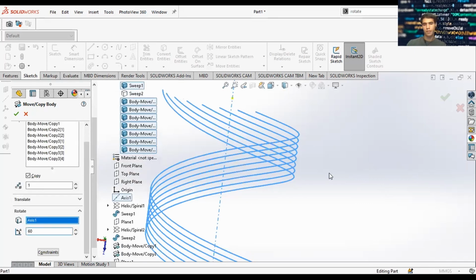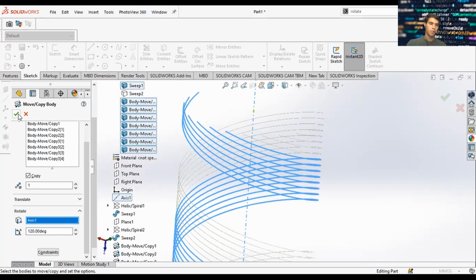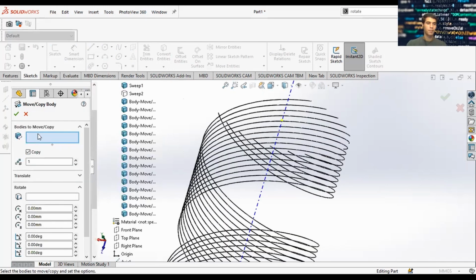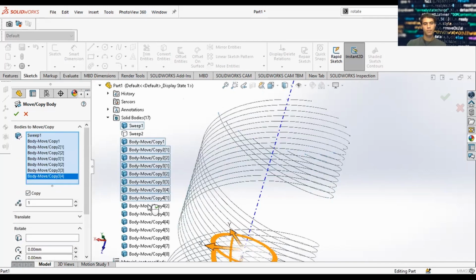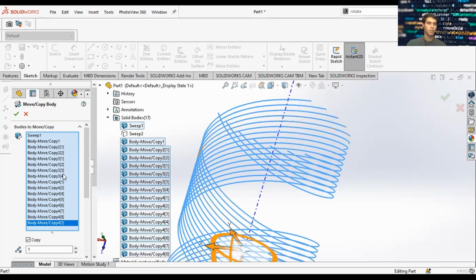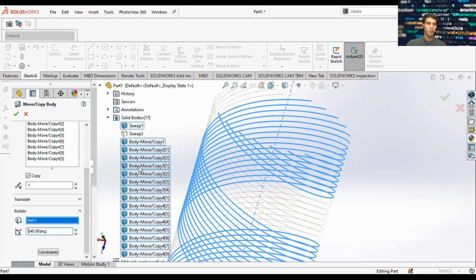So do I hear 60? There's your 60. 120. There we go. 120. And then one more. 240. The price is right.